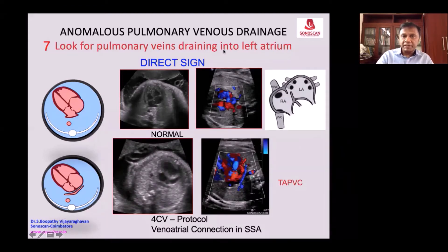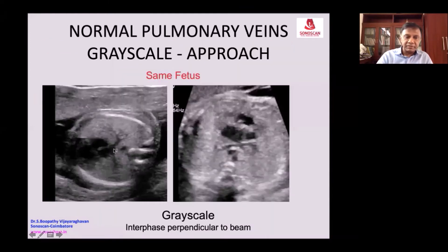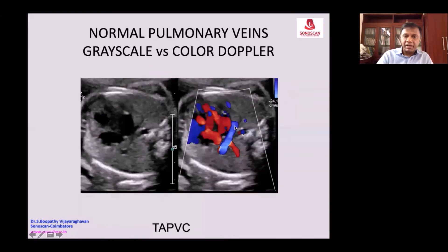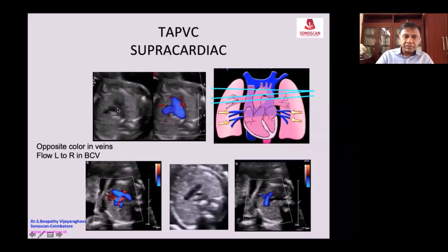You must demonstrate that the pulmonary veins drain into the four-chamber view from the right lateral aspect — you see the pulmonary veins draining into the left atrium. But if you see the same fetus from the apical approach, where the pulmonary veins are perpendicular to the color, you see that they don't drain and are forming a confluent vein going from left to right. The color of flow is different — red and blue in the two veins in the 3VT, depending upon the tilt.